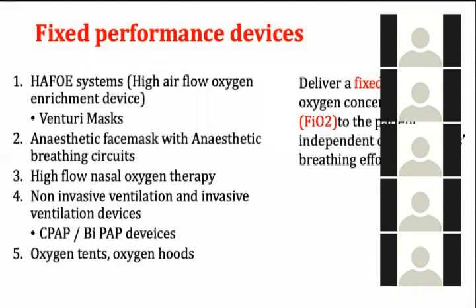It is something like, when you breathe spontaneously, you take a breath, and it varies with some pressure changes, but at a point there would be a rate where the patient takes their breath at the patient's maximum rate, which we generally call about 25 to 30 liters per minute.